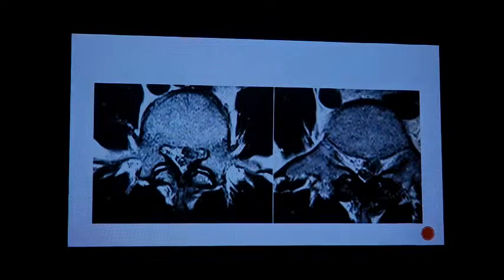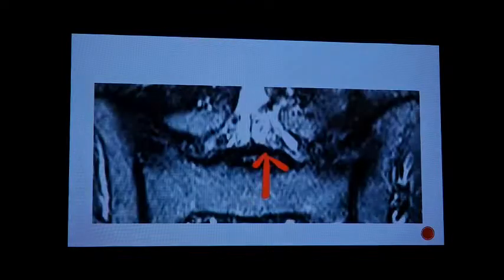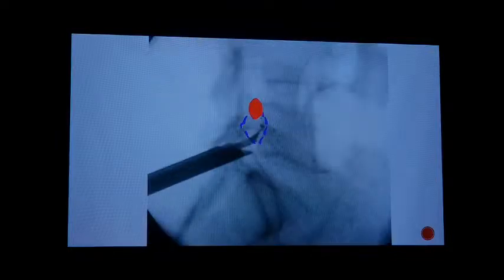The reason why I didn't use the L4, L5 interlaminar window was you need to have special tools like a high-speed burr. Why should I compromise? I should make a tissue preserving approach. Then what I ultimately did was I still preserved the tissue, but I had to make two small incisions. The extruded fragment was removed from L5S1. You could see that my probe could reach up to the inferior border of the pedicle, so that part of the fragment can come out, but still there was the L4, L5 fragment through the parent disc left behind.